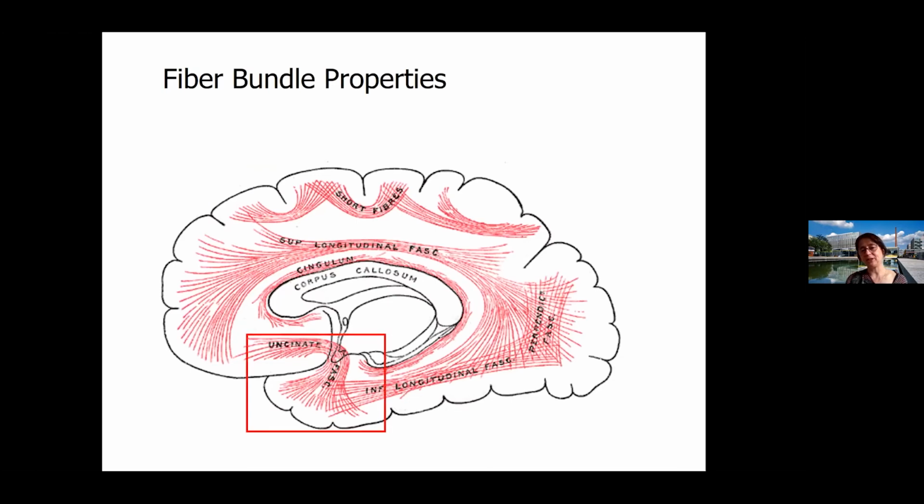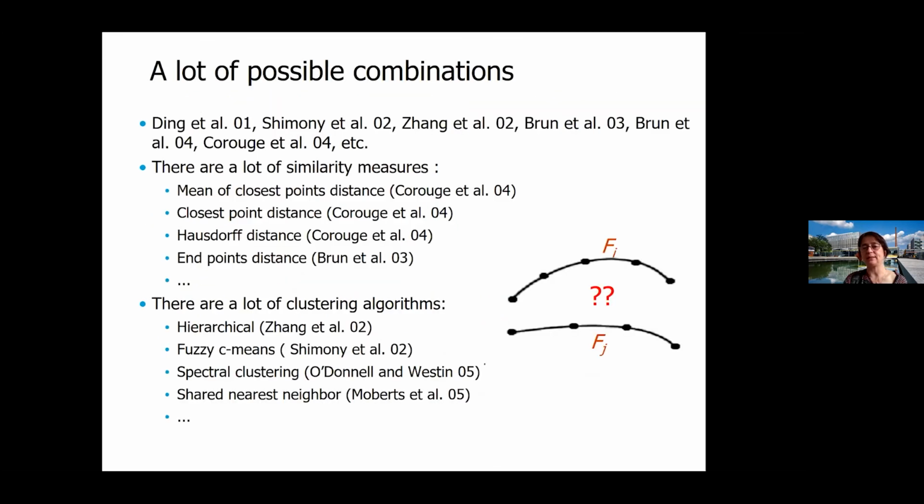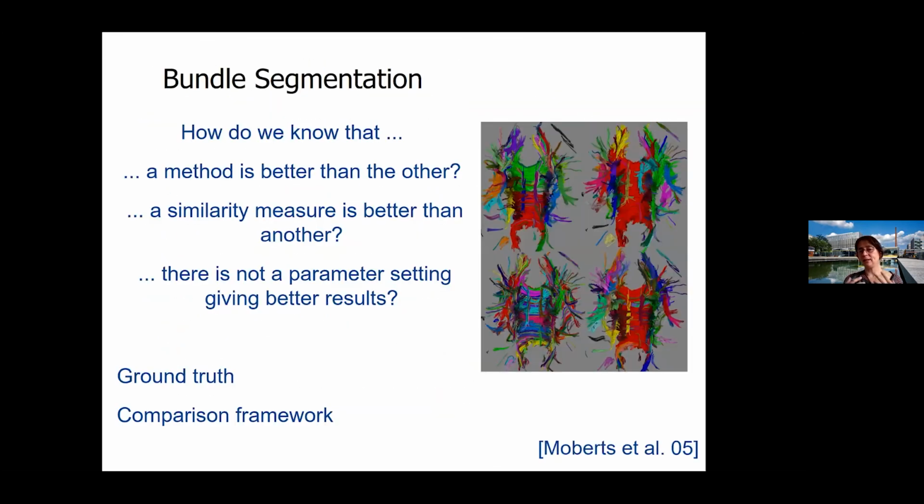Doing segmentation has several problems, like defining what is similar and what is different between the lines. That's not so trivial, right? There are multiple algorithms that try to deal with this. By segmenting some of these fiber structures automatically and then using some visualization strategies, you are able to discern or facilitate the exploration of these data.